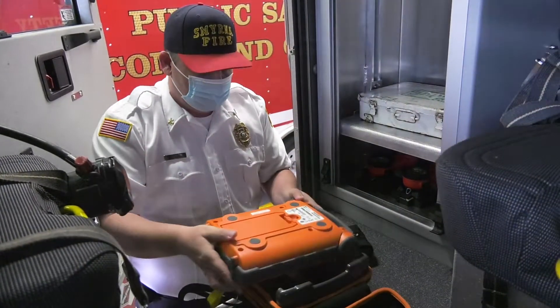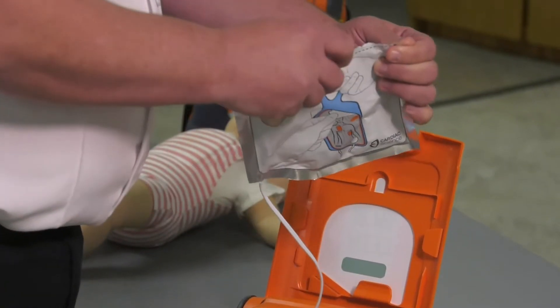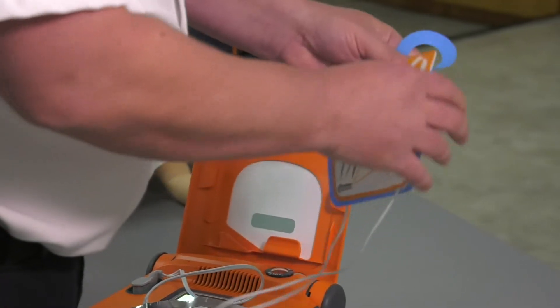The unit is meant for anybody to use. They don't have to be trained with them — it's recommended, but you don't have to be trained because it lays everything out for you. It actually walks you through from the beginning of opening the lid. As soon as you open the lid up, pull the pads out, place the pads. It actually has a picture on the pads showing where to place them, and it tells you every step-by-step what you're going to do through the process of using the AED.